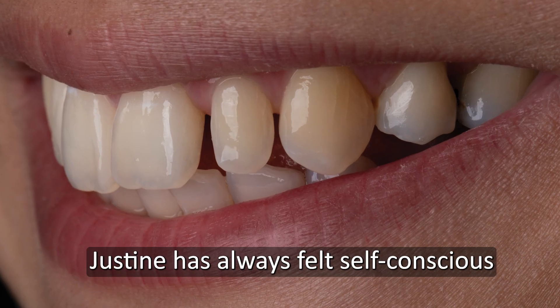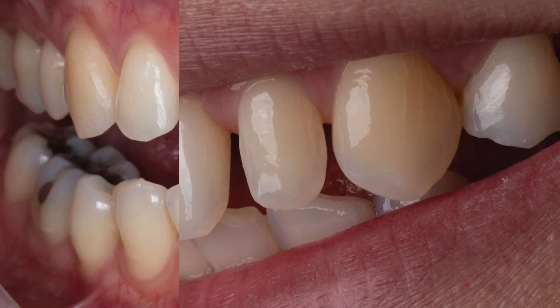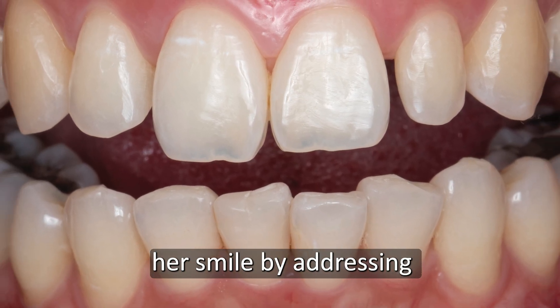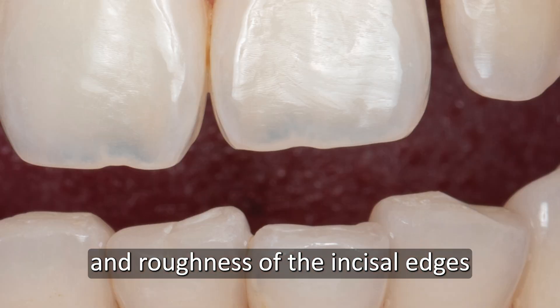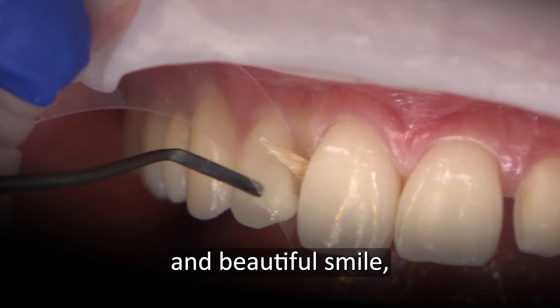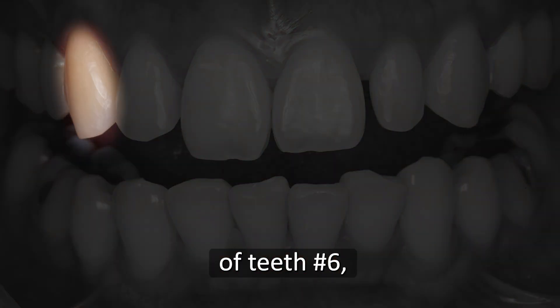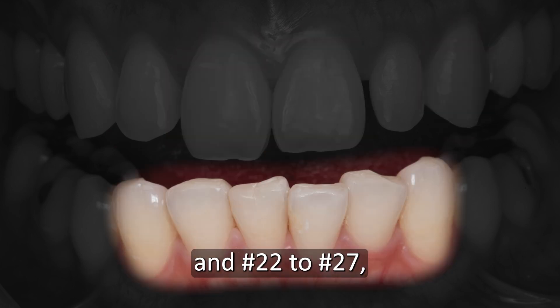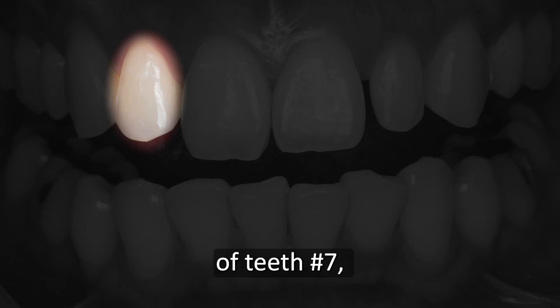Justine has always felt self-conscious of what she called her baby smile. She desired a more mature and confident smile. Together, we decided to cosmetically enhance her smile by addressing her underdeveloped peg lateral number 10 and roughness of the incisal edges of her upper and lower anterior teeth. Her upper and lower anterior teeth were treatment planned for selective minor enamelplasty of numbers 6, 7, 8, 9, 11, and 22 to 27, along with conservative cosmetic composite restorations of numbers 7, 8, and 9.